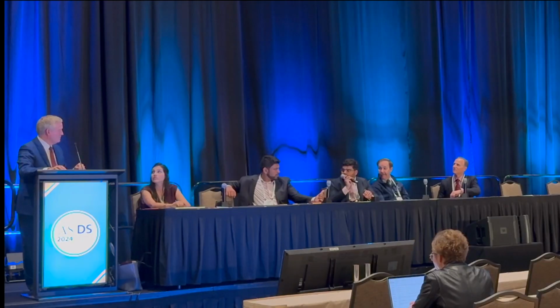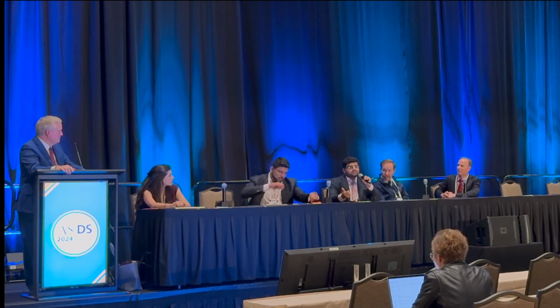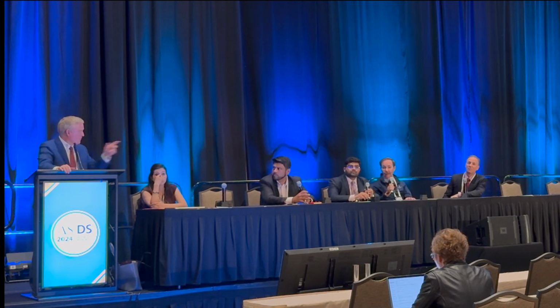Okay. When we are doing that, one is looking at the sebaceous glands. You start seeing normalization of the sebaceous glands, and that is an endpoint. The second is getting to a level where the dermis seems plain, and in these cases, the erbium YAG with the scanner helps better as compared to a manual scanner. If your hand is used to it, then it's good. The third is when you do erbium YAG and you start seeing an increased amount of bleeding with a plain surface, that is when we usually stop.